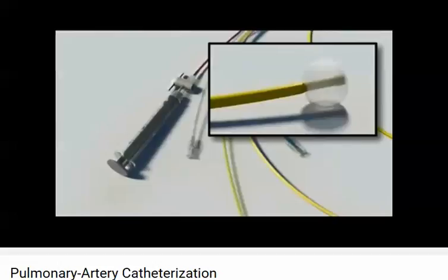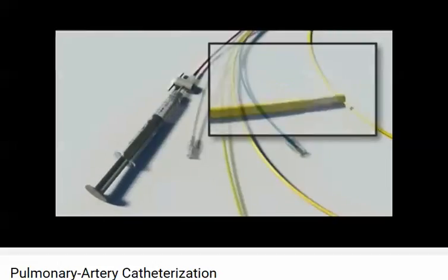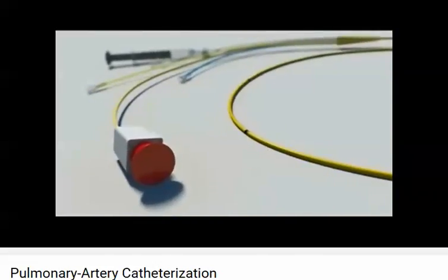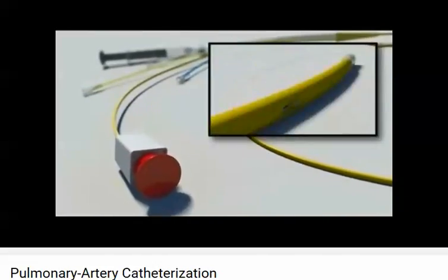It is essential that the balloon be inflated whenever the catheter is advanced, and then deflated whenever the catheter is withdrawn. The final port is connected to a thermistor near the catheter tip and can be connected to a computer for measurement of cardiac output by thermodilution.